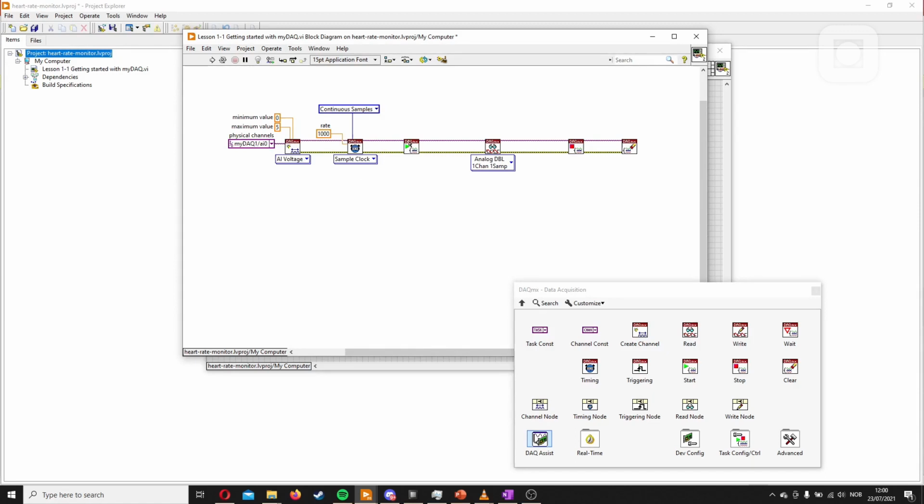Next, we will start it. This doesn't need to be configured in any way. It just starts when it runs over this one. And then here, we have one channel and we want continuous sample. So what we do is with a single channel, multiple samples, and for ease, we'll just choose a double. You can choose a waveform, then you have the time put into it, but we don't need that for now.